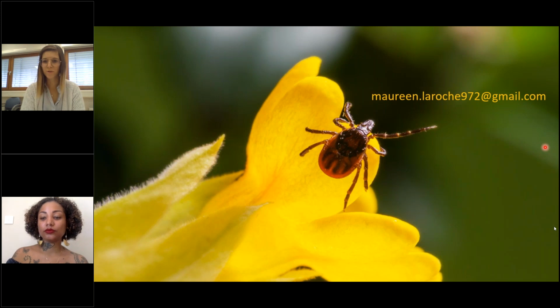Okay, so there's also a question from Isa. Very nice presentation, great results with legs, but did you use another part of the body for your ticks or mosquitoes? If so, were there any differences? Yeah, that's a really nice question, actually, because when we did the work on Plasmodium especially, we bumped into an issue. We couldn't distinguish non-infected versus exposed mosquitoes, because among the exposed you have two categories, those who are actively infected and those who were just exposed and cleared the infection. What we wanted to target was the actually infected mosquitoes, so we switched from the legs to the cephalothorax, which is where the sporozoites are located, and we had quite nice results.